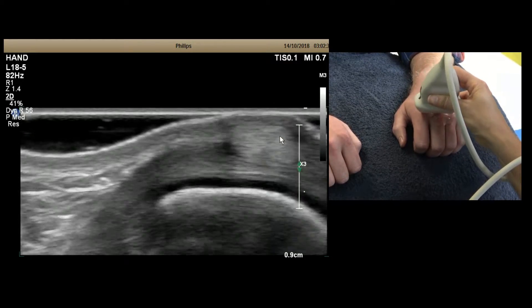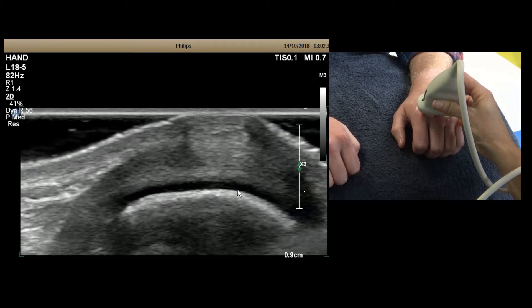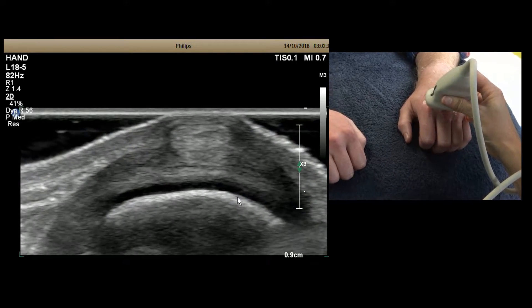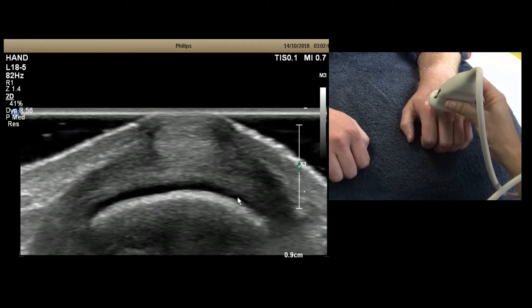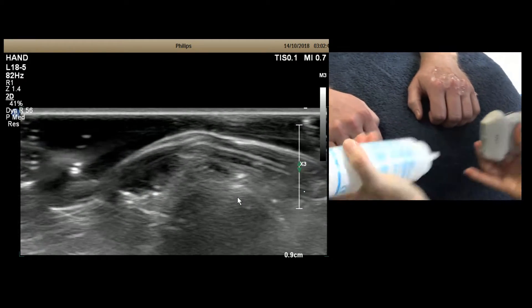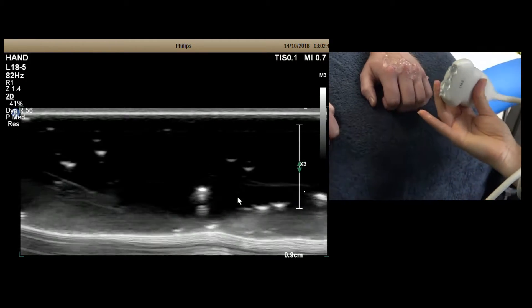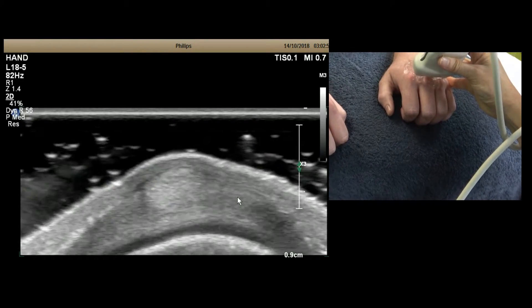These are very fine structures, but if they're damaged they become very thick and obvious to see. Once the band splits, it can allow too much movement of the tendon and it can flick off the central position of the finger. So what you do is ask the patient while scanning to pull tight and form a really tight fist slowly.